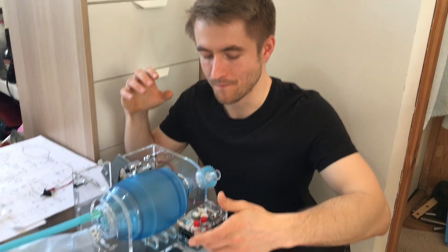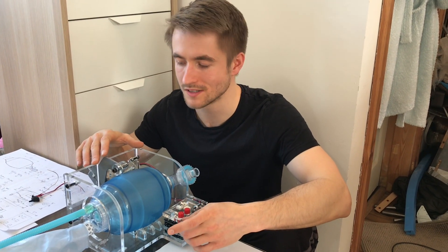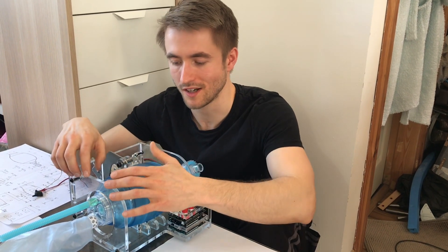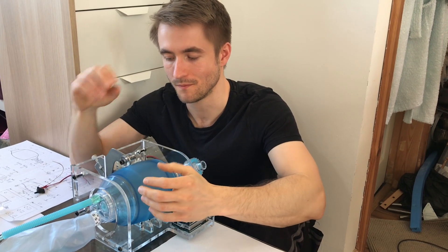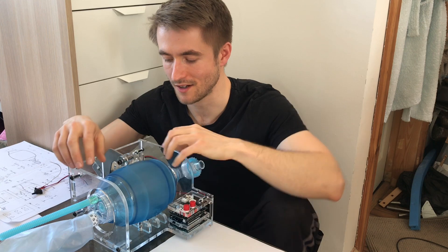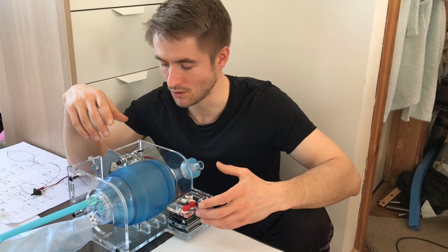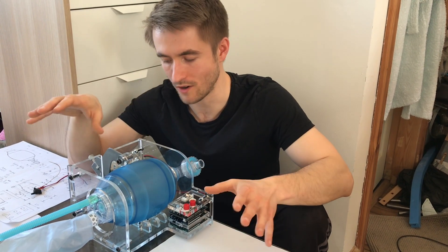The general idea behind this is to use components and parts that can be sourced really easily in pretty much most places in the world, using manufacturing processes that are fairly available. Somebody can download my design from Instructables or GitHub — download the DXF for laser cutting, send it to their local laser cutting house, get all the parts back, assemble it quickly, then download my shopping list for all the components, fit them together, upload my Arduino code, and it'll work exactly the way it does here.